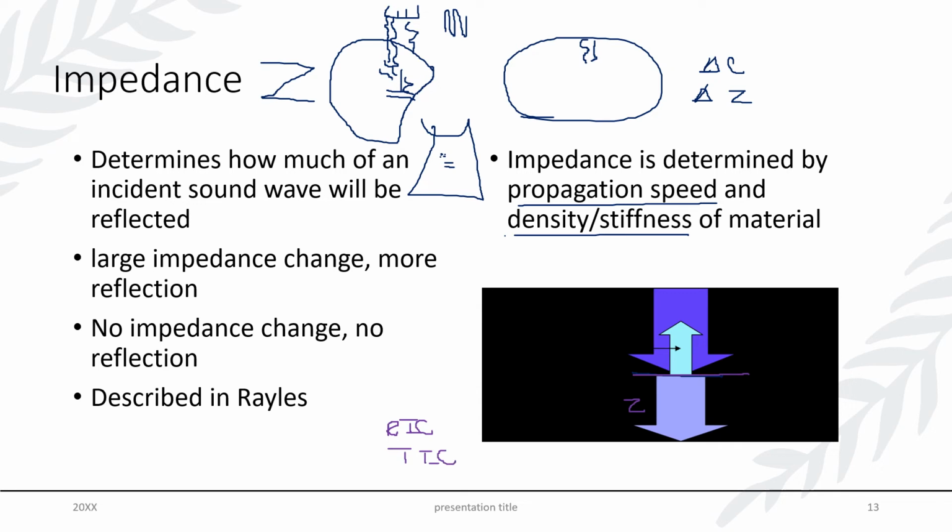Now, for you guys, that's probably not going to be a huge consideration, but in visualizing how this works in the body, it's important to remember it's not just one echo coming in and the whole thing being reflected back. It's one sound wave coming in, part of that sound wave being reflected back, while the other is allowed to continue penetration. As it continues that penetration, the amplitude is getting more subdued, which is caused by the decibel or attenuation decrease that we know occurs every centimeter of tissue.